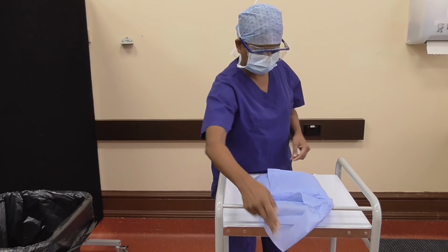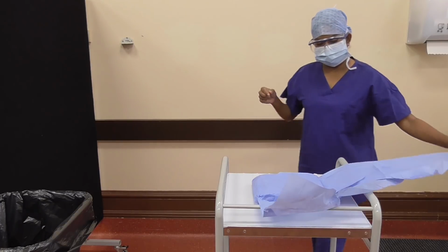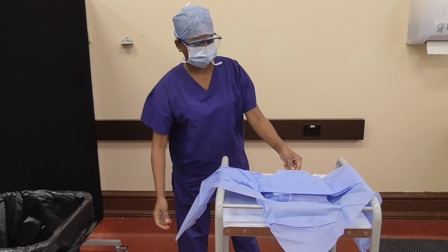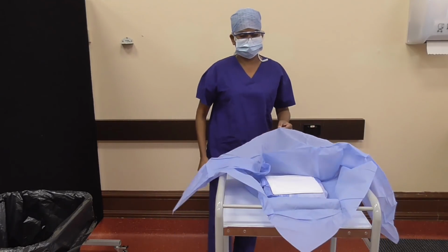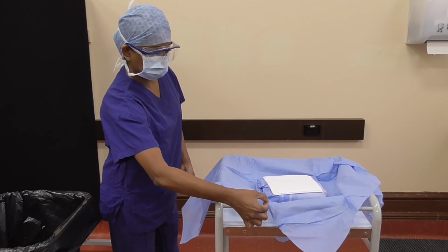I will open the pack by only touching the corners and ensure that I am not crossing over the sterile field but going around the trolley. The whole trolley has to be covered.